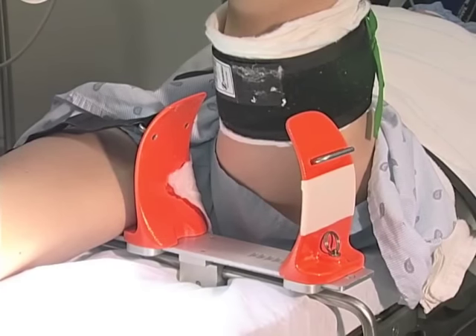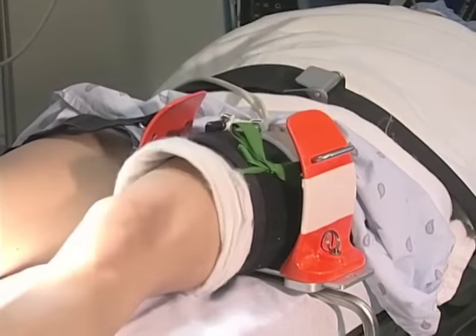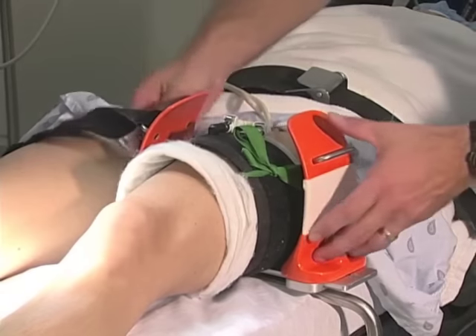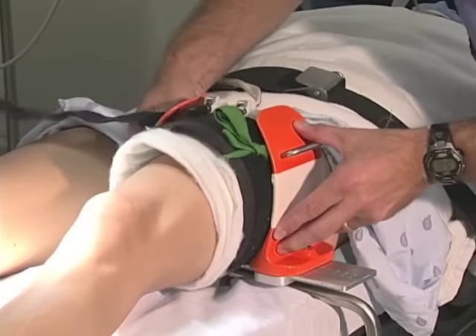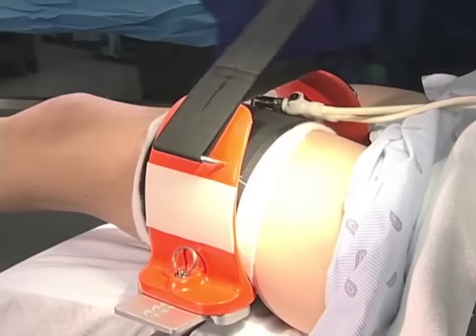After the tourniquet is placed, the leg is lowered into the circumferential leg holder. The leg holder is squeezed closed, the straps are placed, and the foot of the bed is lowered.